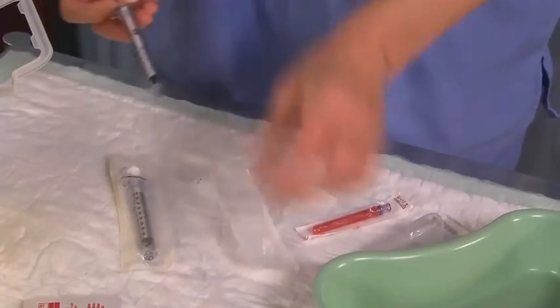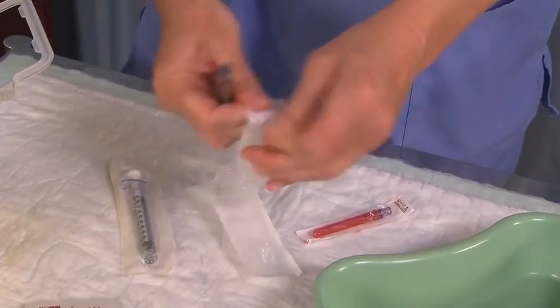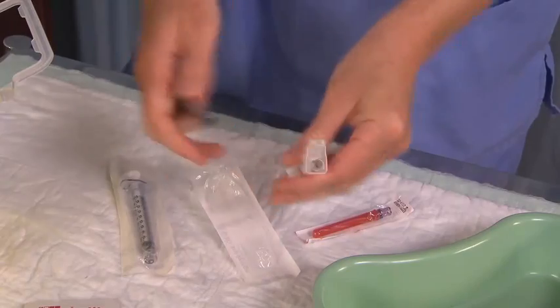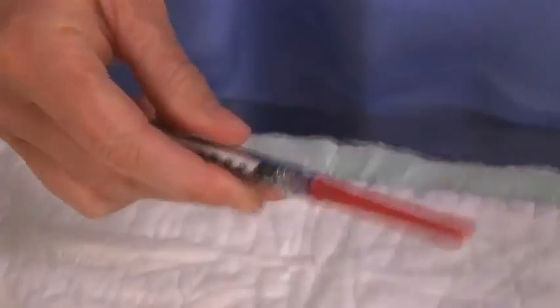Inspect the medication for crystals, lumps, or any discoloration, and ensure that the medication is clear. Attach a 20 to 22 gauge needle to a 1 milliliter syringe ready to draw up the medication. Use a filter needle if drawing up from a glass ampule.